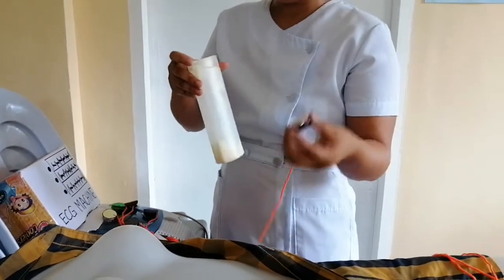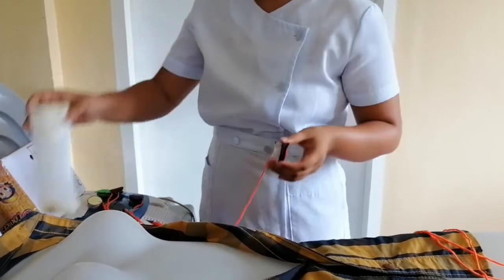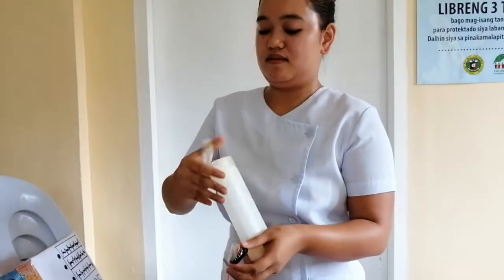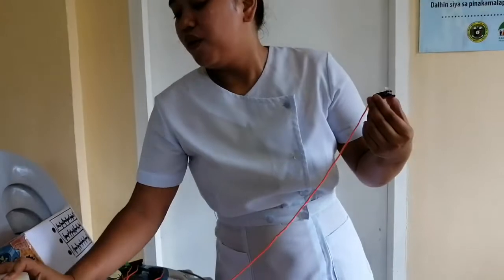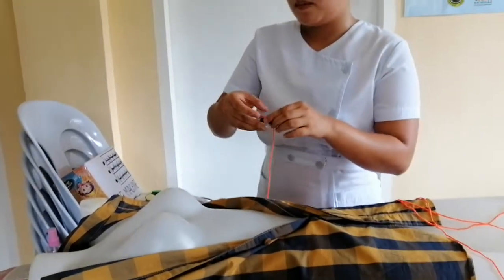The V1 lead is the first one to be placed on the client's chest. So let's put an electrogel. So we are going to locate this V1.